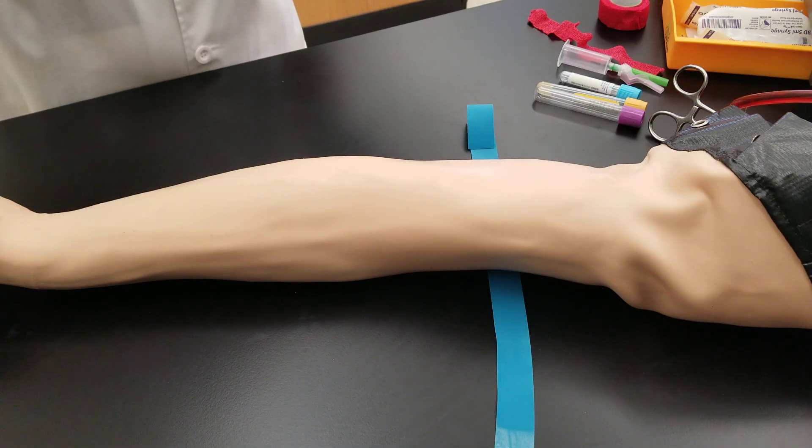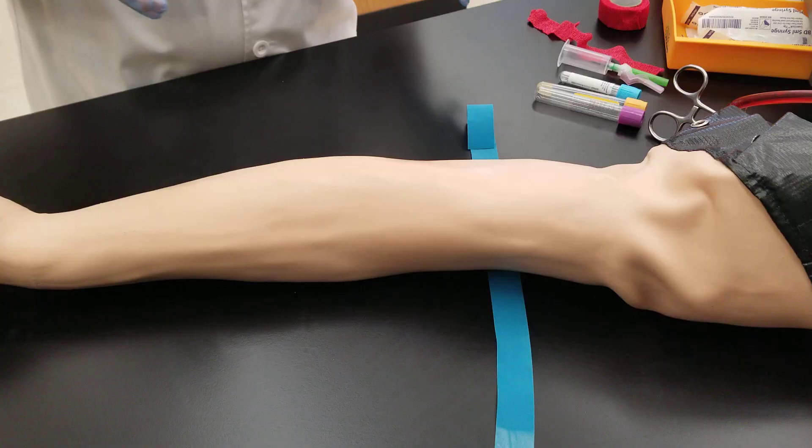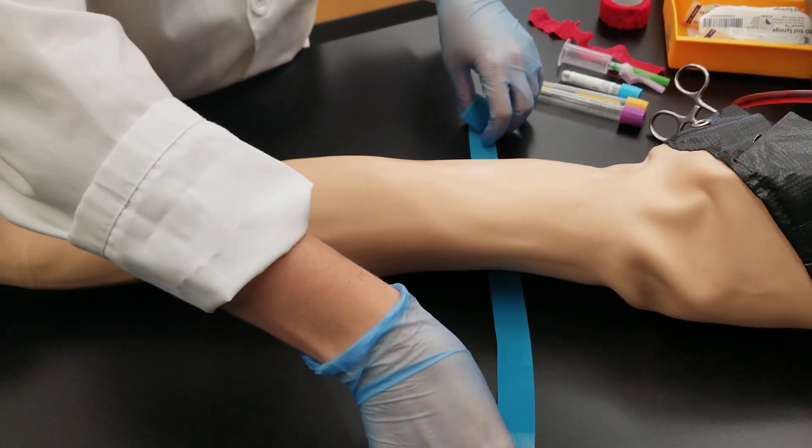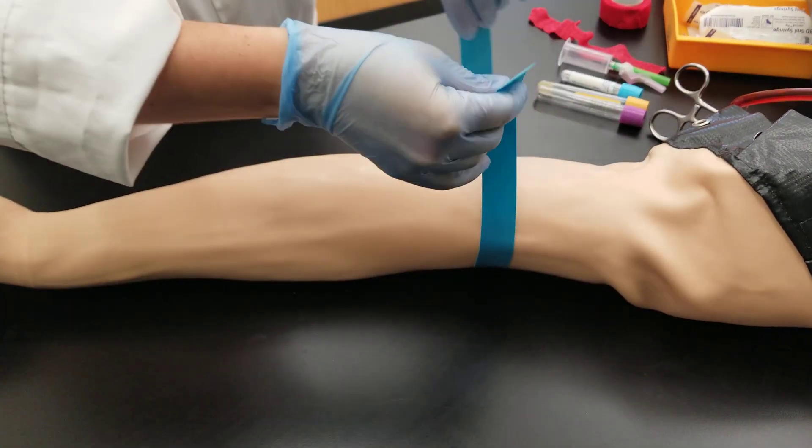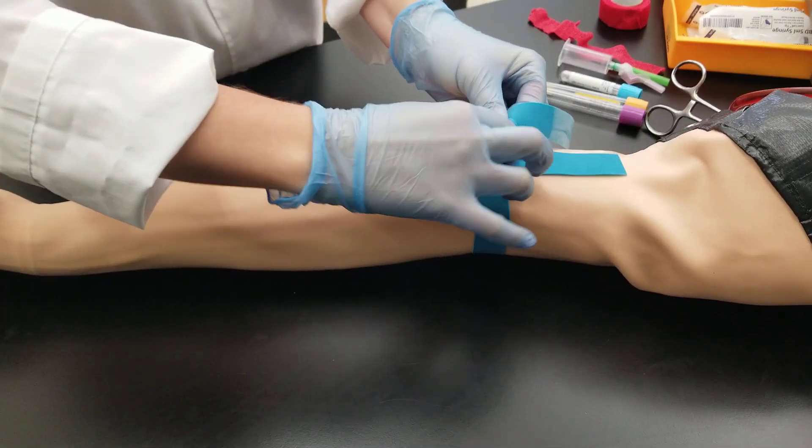So I've already come in, I've talked with my patient, identified myself, why I'm here, and what we're going to do. The patient's ID was already established with two identifiers, three if required by your facility.